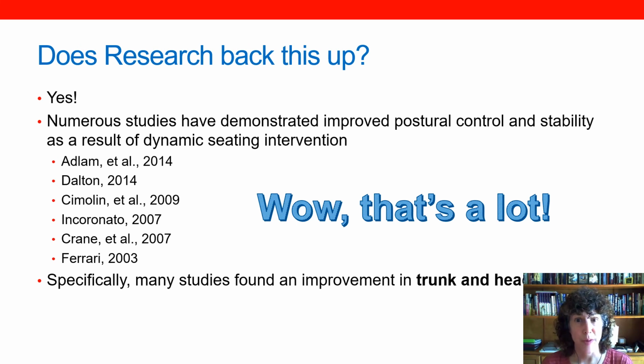So does the research back this up? Well, yes, it does, which is great. There have been numerous studies which have demonstrated improved postural control and stability as a result of dynamic seating interventions, and they're listed here. So we have quite a lot.